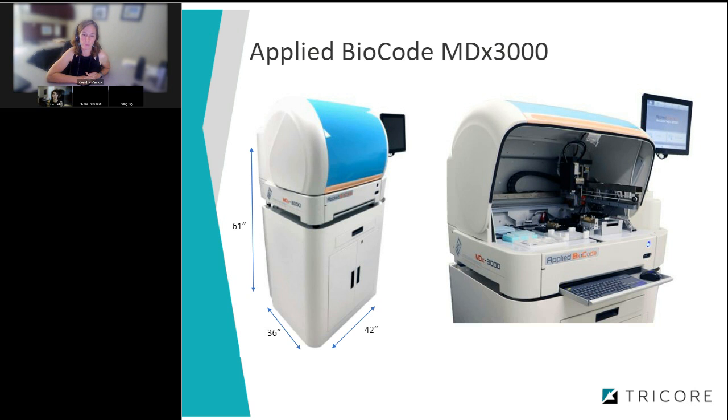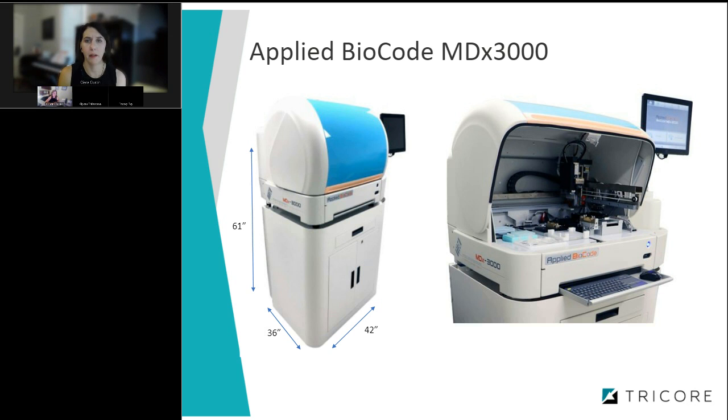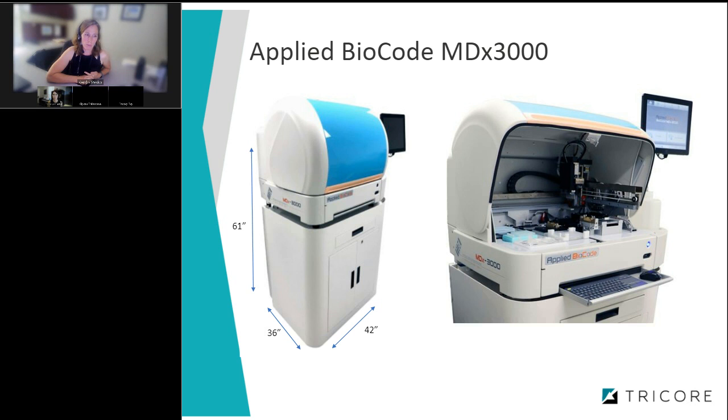And since you have a BD Max, what was your motivation to use the Applied BioCode method? When we initially performed the evaluation, there were some issues with false dual positives on the BD Max. And so we felt like the accuracy on the Applied BioCode was better.